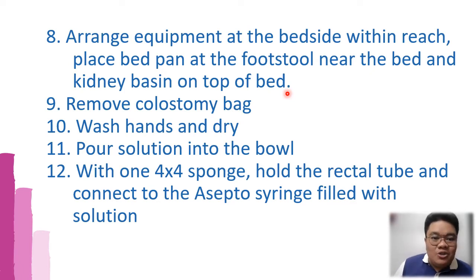Now, you need to remove the colostomy bag because we're doing your irrigation. Then you wash your hands and dry because after that it will be already a clean procedure. Then pour the solution into the bowl. The solution will be used for irrigation.